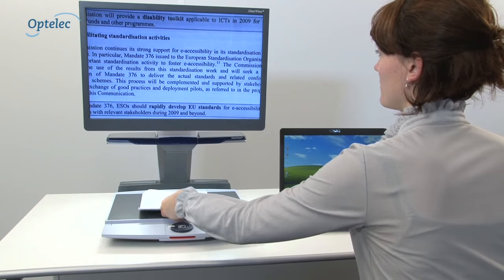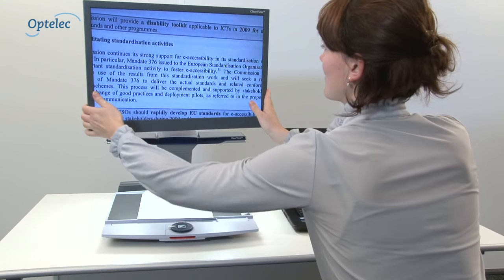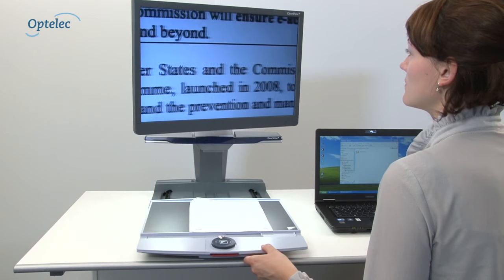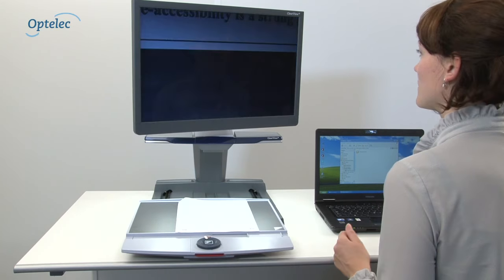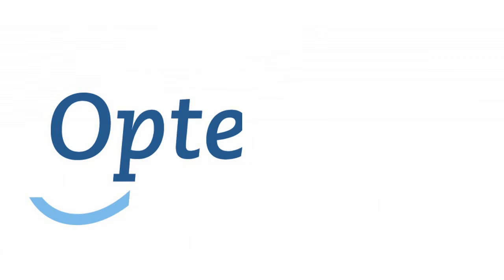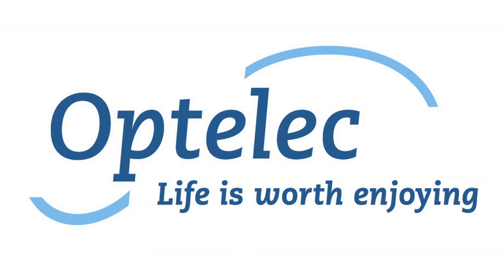If you're using a PC and an Optelec Clearview Plus, you can use both in combination, using an optional footswitch to alternate between your computer and Clearview Plus image. For more information, visit our website at www.optelec.co.uk. Optelec — life is worth enjoying.